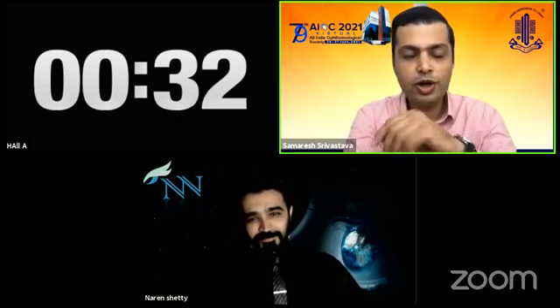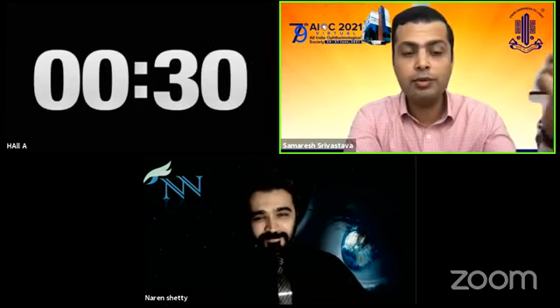Definitely. A great point, Dr. Naren. For any cataract, trampolining is not a good idea. Particularly in polars, I encourage all the junior surgeons listening to at least do a sort of viscoelastic exchange to maintain the chamber. But if you can get away without any fluctuations whatsoever, it's probably a miraculous surgery. And like you said, it's a no-brainer.